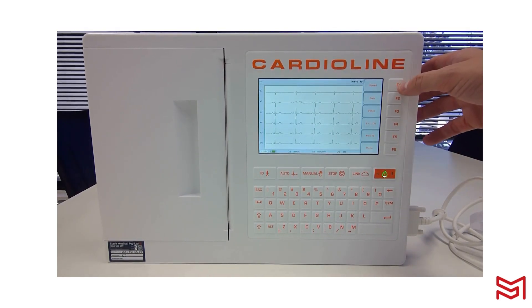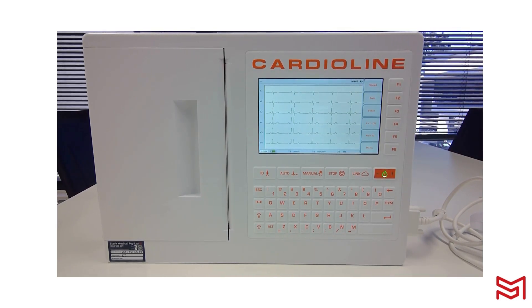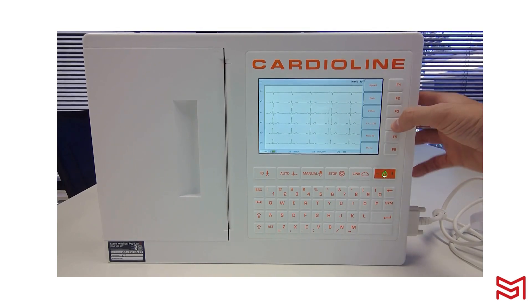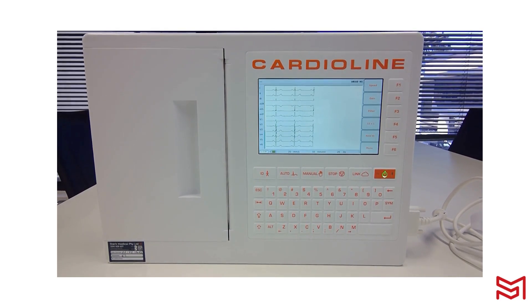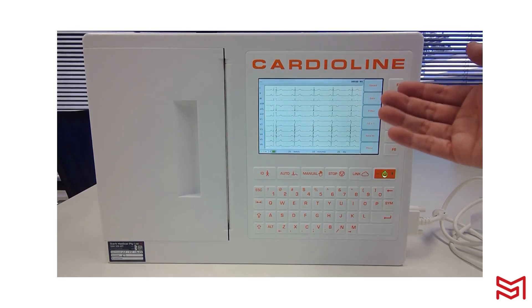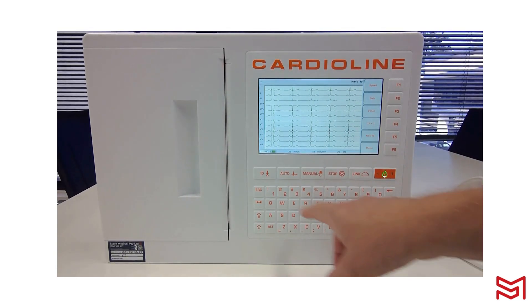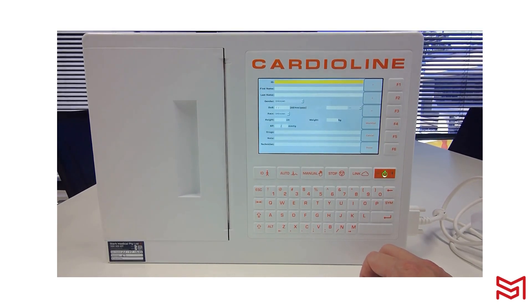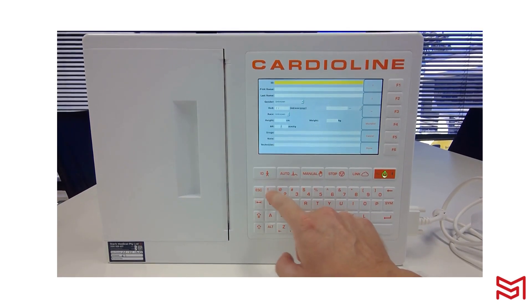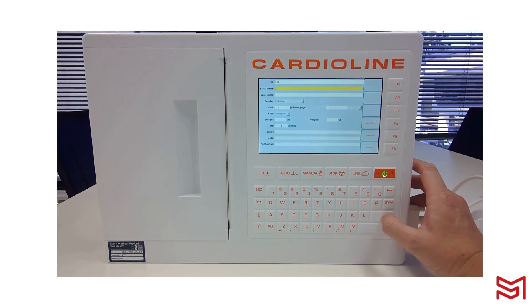On the right-hand side of the device you can adjust the settings mid-exam if you choose to — I'll show you later how to customise them so they're the same every time. I'll get a 12 by 1 view here, and we can see all leads fully visible on screen. On the left-hand side of the device you'll see an ID button, where you can enter a patient ID via the keyboard.